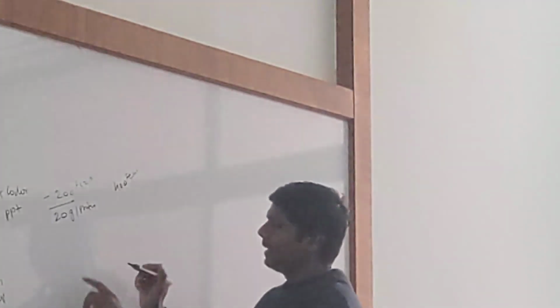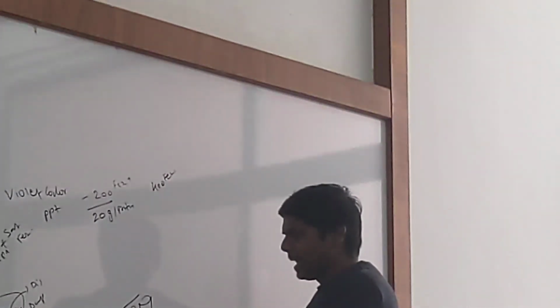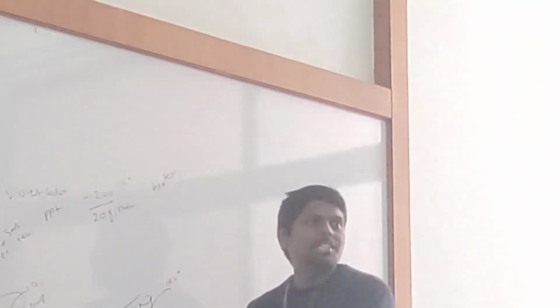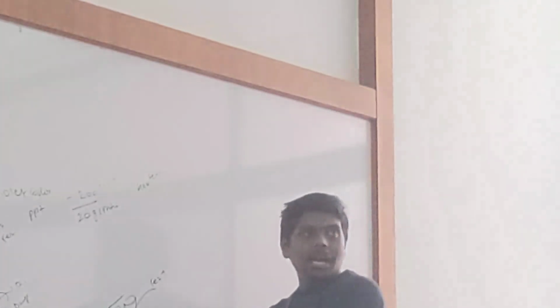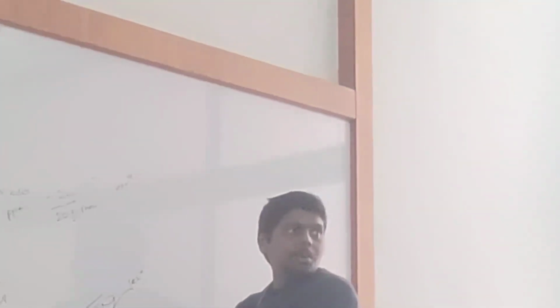So what I did, I took this protein in the serum sample. To this serum sample, I have oversaturated with iron molecules that are present in the reagent. I have excessively added iron molecules to this protein. Then I will take the second reading, with oversaturated iron molecules.